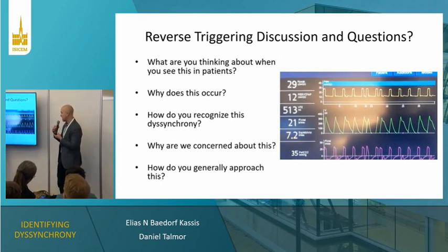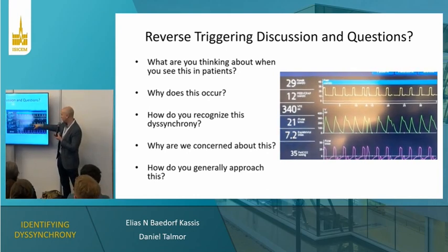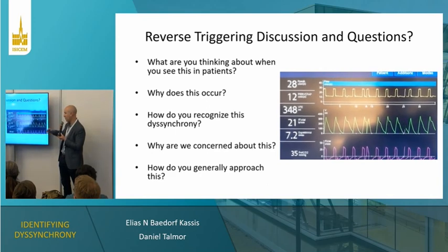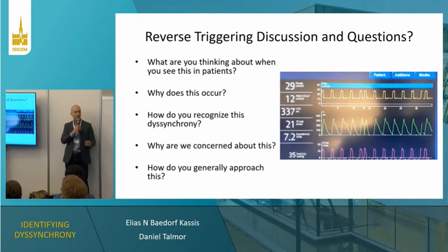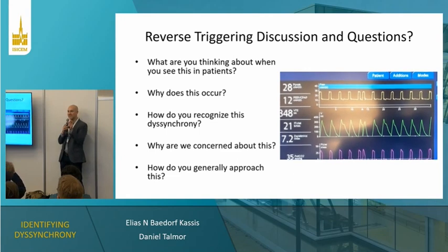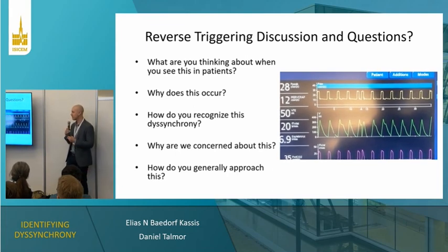And so here's that same patient that we were talking about, who's having a mixture of reverse triggering events here, which are not actually causing breath stacking events, okay? This is a really key differentiation: if reverse triggering occurs early or at a lower amplitude, or if it doesn't extend into the expiratory phase, then you're not always going to be able to see it by the breath stacking events that occur.